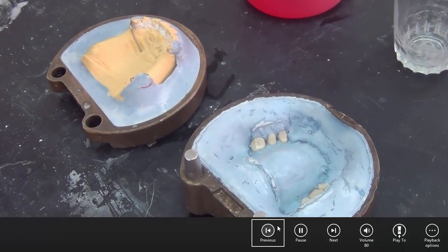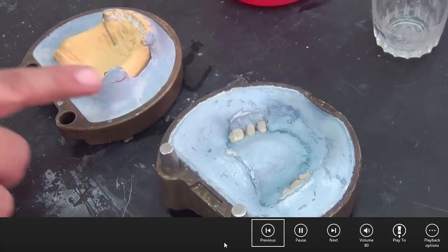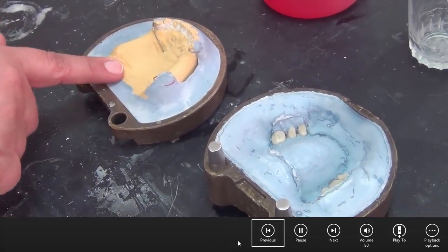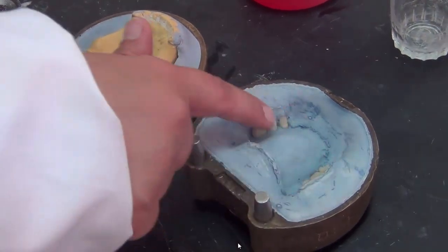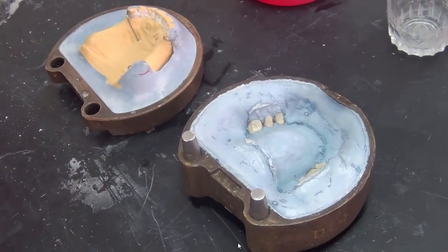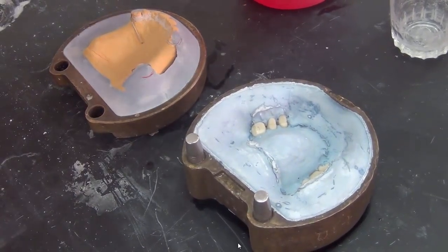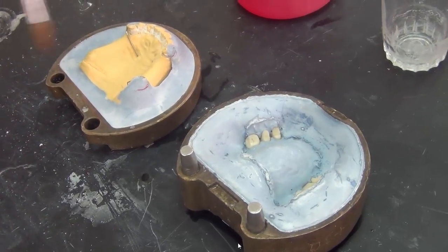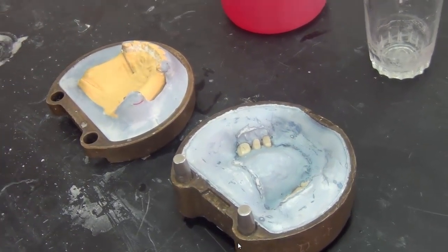Now the dewaxing step is complete. We have the lower member with the cast, secondary cast, and the clasps inside. We have the upper member with teeth in place. It's still warm. While it's still warm, we need to do a separation layer because we're going to add acrylic and we don't want it sticking onto the stone and the plaster. We want it to separate easily.